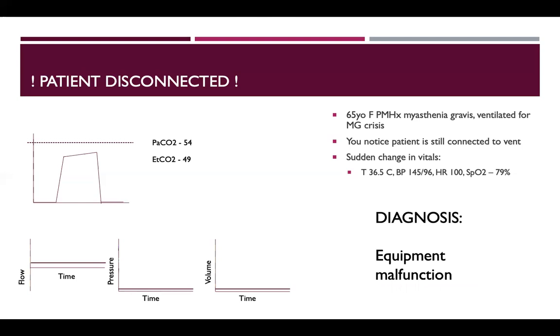And even though things look like they're still connected, if the ventilator is saying that something's wrong, it's just that the equipment isn't working. And yeah, that's basically it. I have no other deep words to say about that.